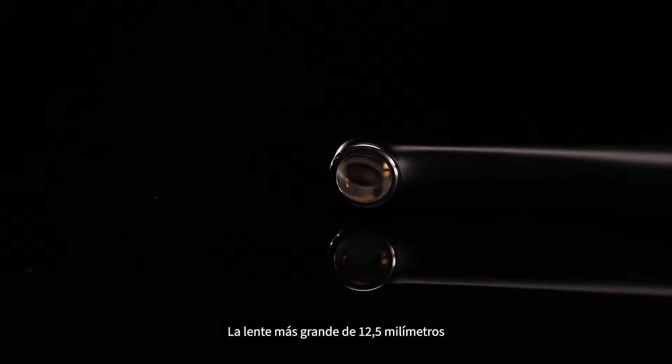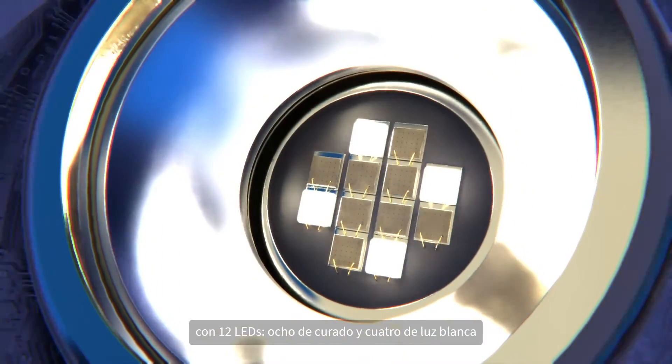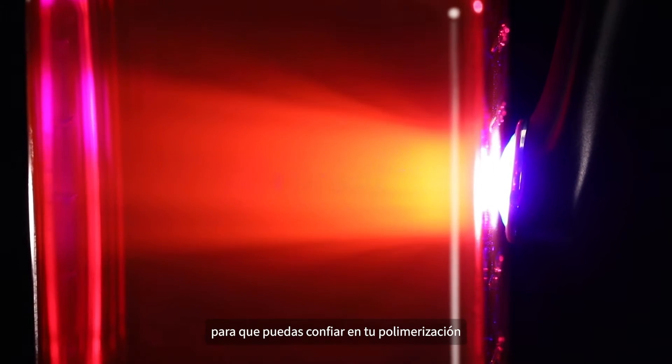The larger 12.5mm lens provides unparalleled coverage with 12 LEDs — 8 curing and 4 white lights. These deliver superior curing depth and beam collimation, so you can be confident in your cure.